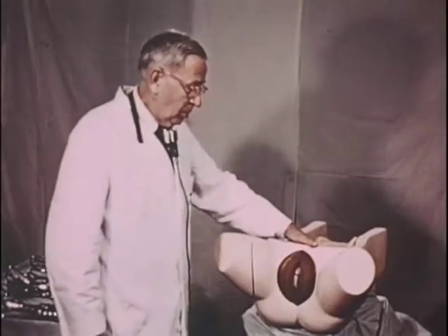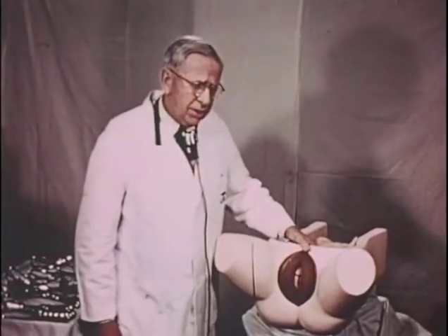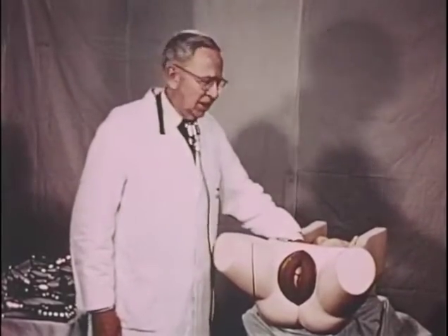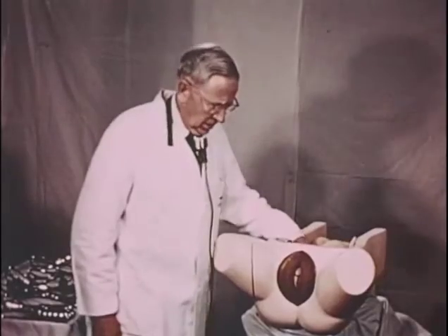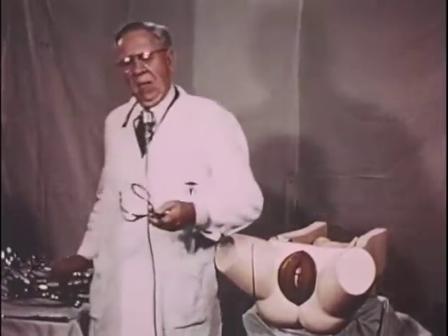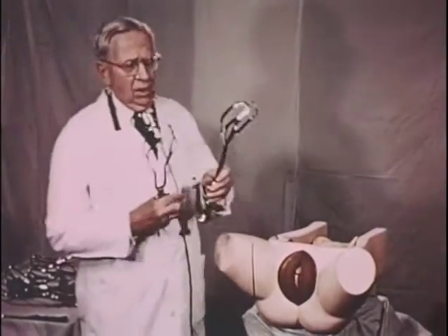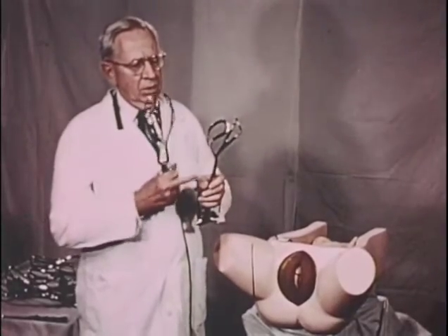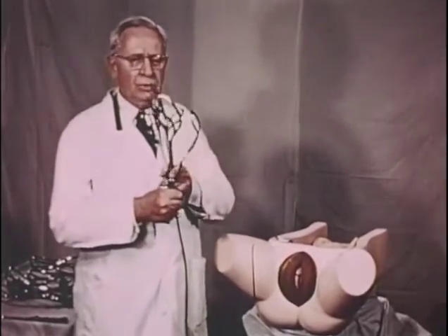We know that the cervix is fully dilated, and we know the exact position of the head, and we know the station. Now, the final prerequisite of the choice of instrument depends in anterior positions largely upon the shape of the head. Remember that the classical instrument is divided into two groups, those with shanks overlapping and those with separated shanks.